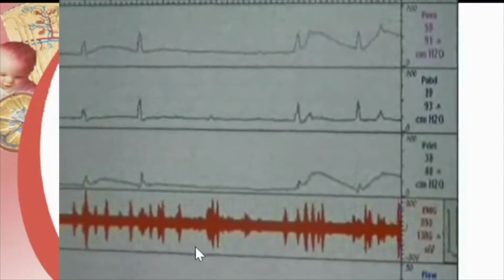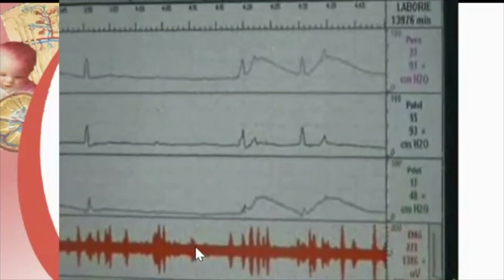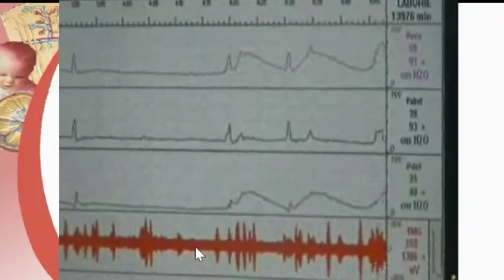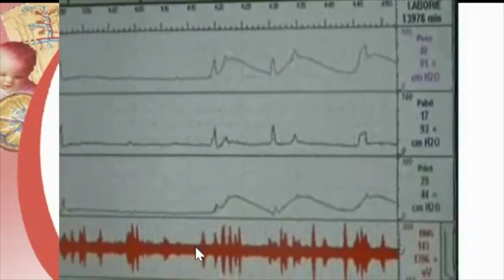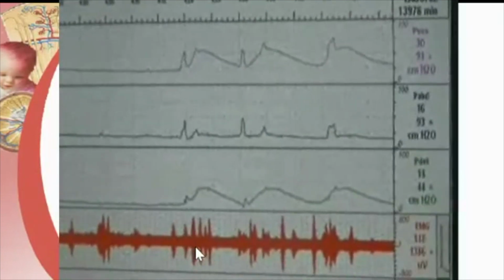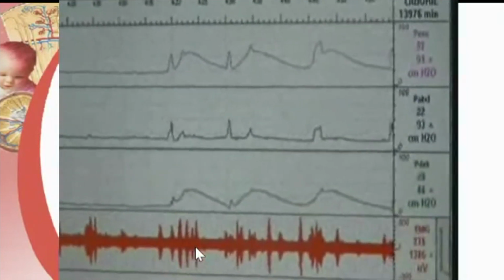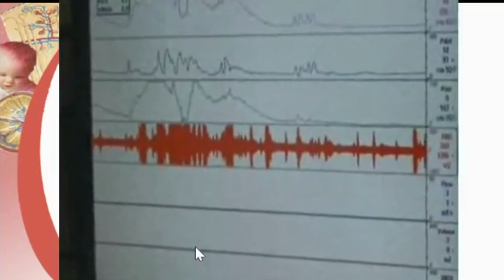In this patient, we are taking the machine to the radiology department to do it in the form of video urodynamics. Here we can see that there is a contraction wave happening, and at the end of the contraction wave, the child has started crying, and then there will be a rise in pressures. I'm sorry, there is an overlapping voice sound from the original study itself. So that is the original voice of the video recording. So you have to watch for the urine, and that is the screening being done, and you can see that the bladder is emptied, and that is the end of the study.